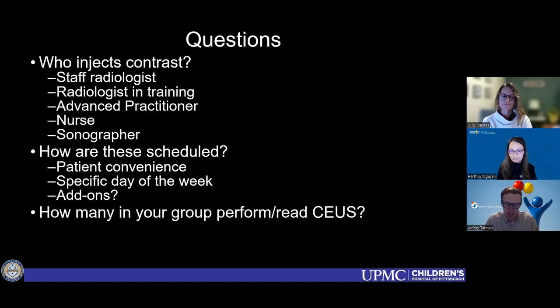And it ended up, I think, pushing us away from doing these examinations because hepatology would order them, and then it would be like 2 months before we could get them on the schedule, just with all those moving pieces. So we ended up moving, at least for the liver lesions, so that now any sonographer and any radiologist can be involved in those examinations. And I think that's worked for us at this point.